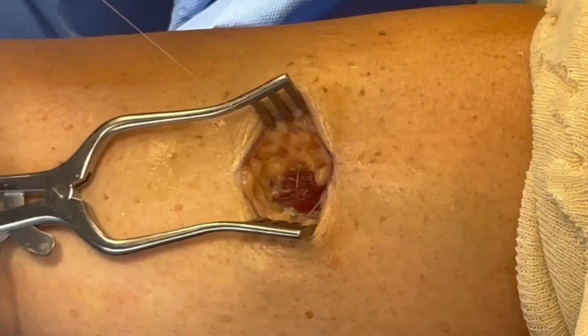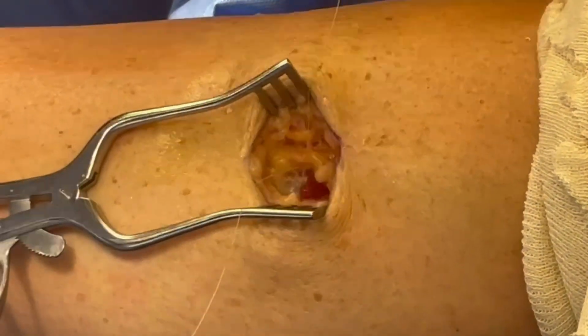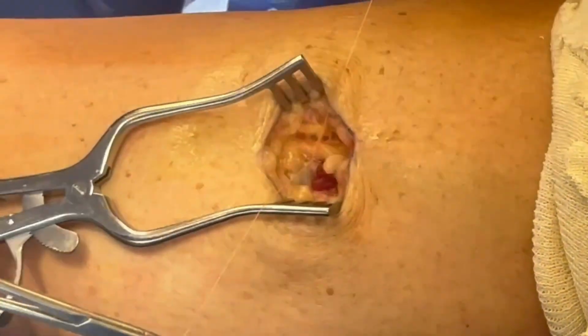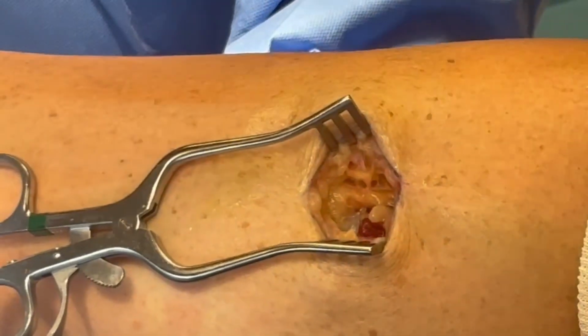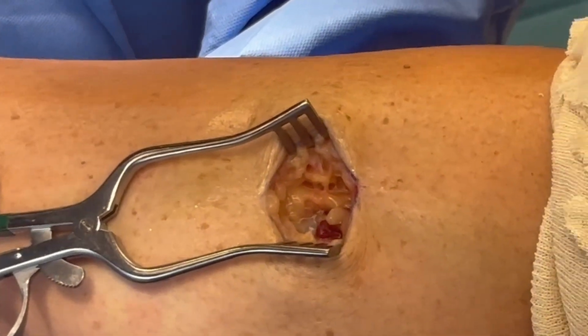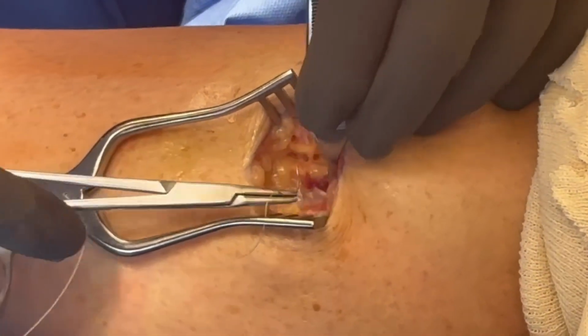And then for skin closure, I've been using an adhesive suture retention device with 2-0 nylon. With those adhesive suture retention devices, you can either use a simple or a vertical mattress. If I'm going to use a running subQ closure with barb suture, I'll do the vertical. If I'm just using horizontal mattress type sutures, I'll use a simple type suture.